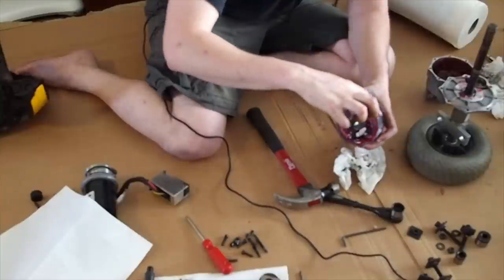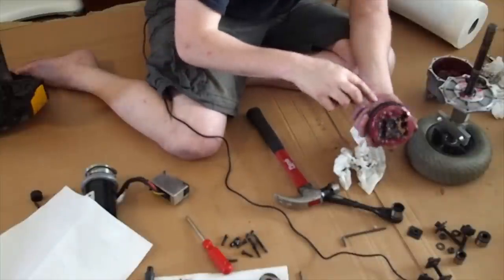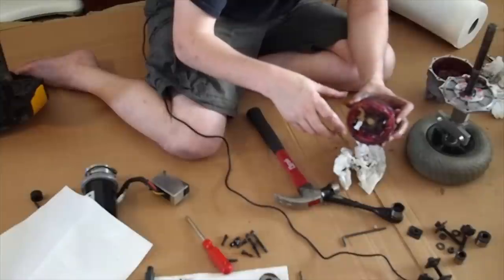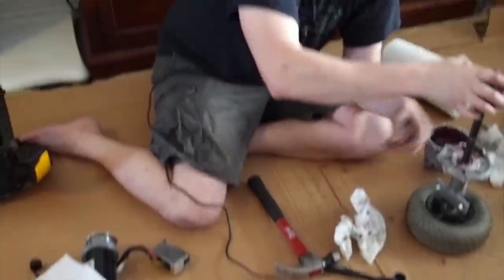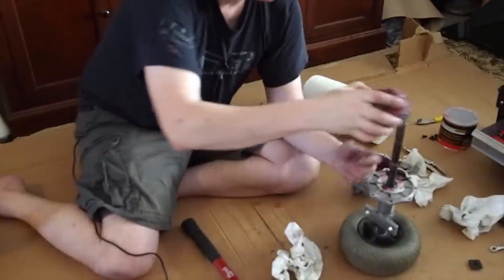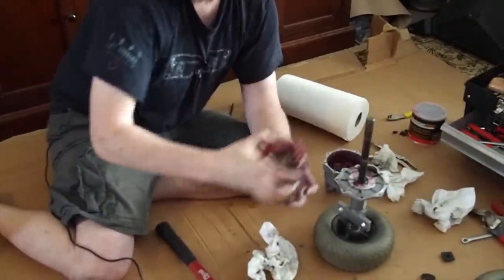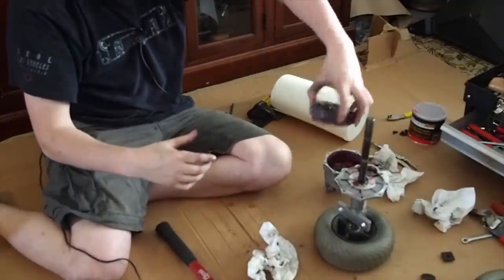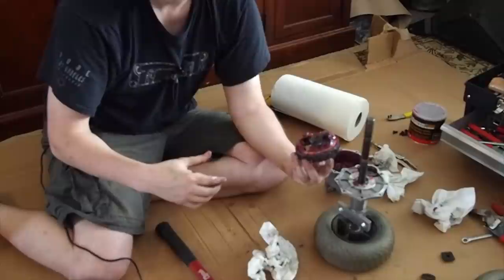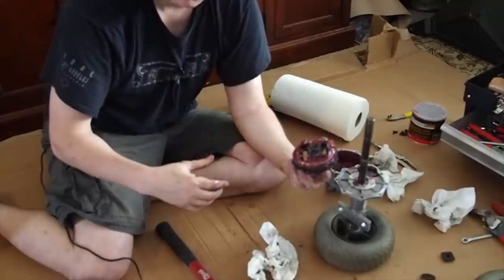It looks like it's polished on the top side and the bottom side isn't. So what does that tell me? That tells me, and it was sitting in like this. I took it out and I put it exactly the way I took it out. So it was sitting in like this. Maybe what I did is I put this in upside down. Maybe this goes this way and not this way. And that's possibly what I did wrong.